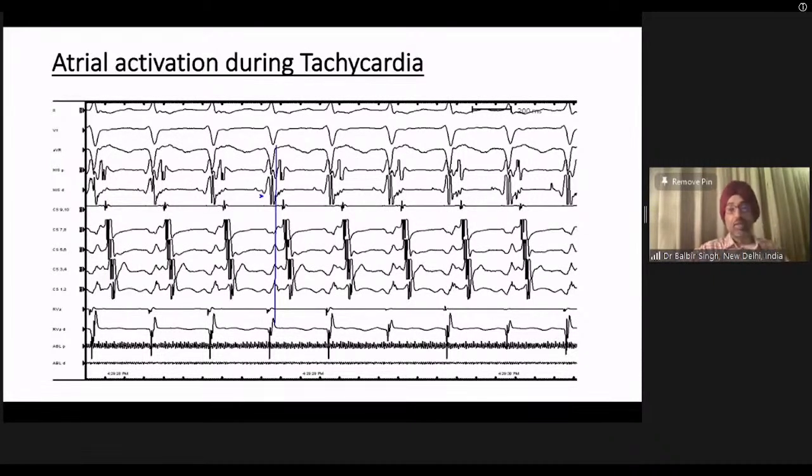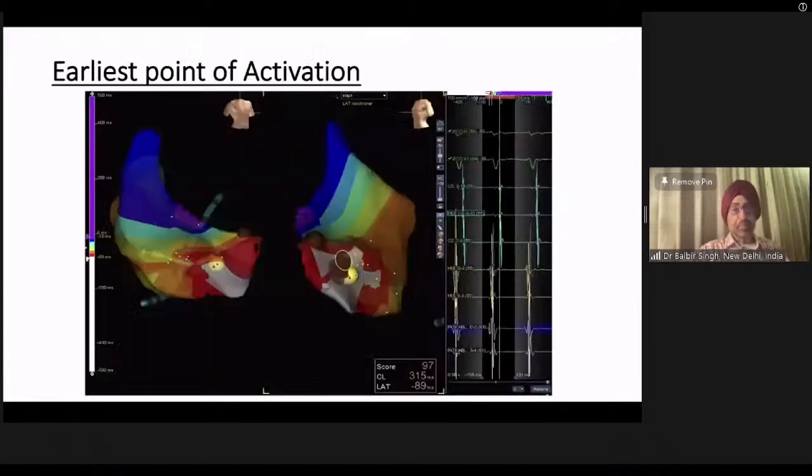Now you see a good H on the electrograms, and clearly the A on the His bundle electrogram is the earliest, no doubt about it. In these pathways, if you have a very good sustained tachycardia induced, my idea is to map during this SVT, looking in the anterior area, anteroseptal area, and right lateral and mid-septal, so that you have a reasonably good activation map lined up for you for ablation.